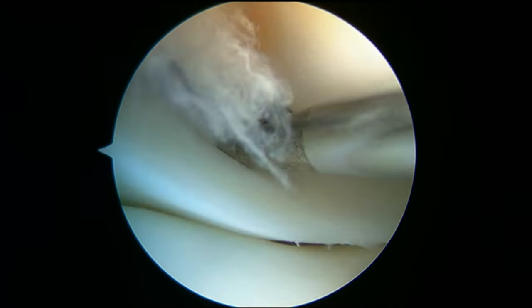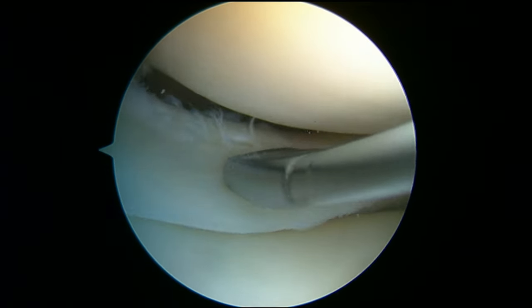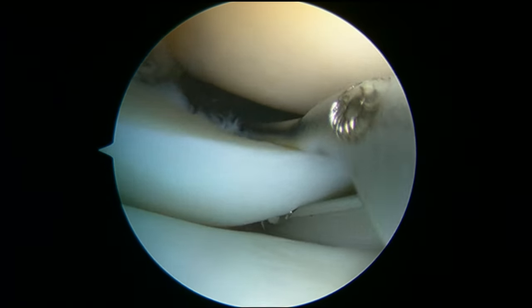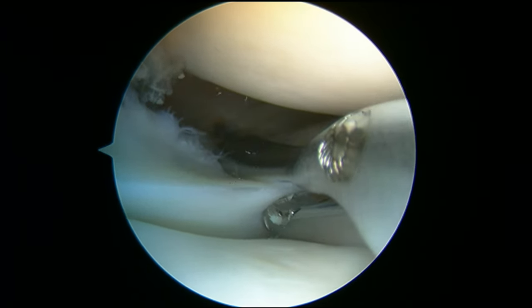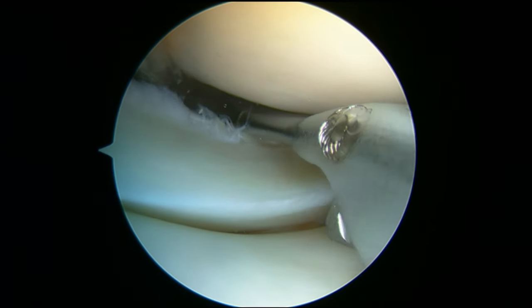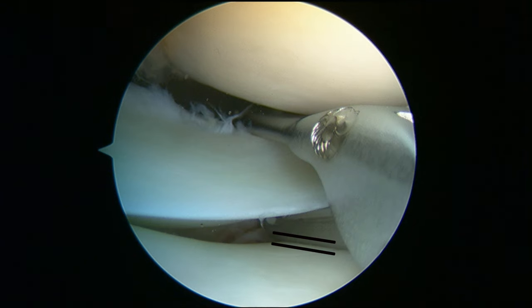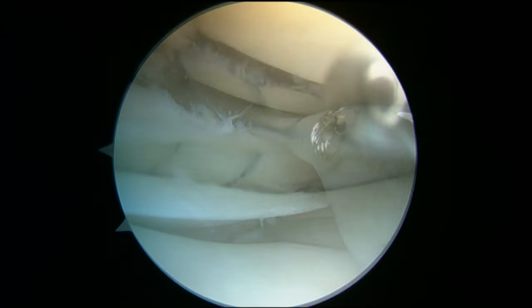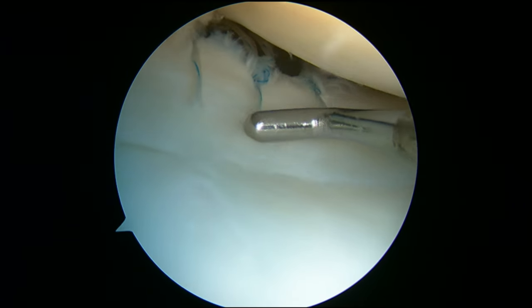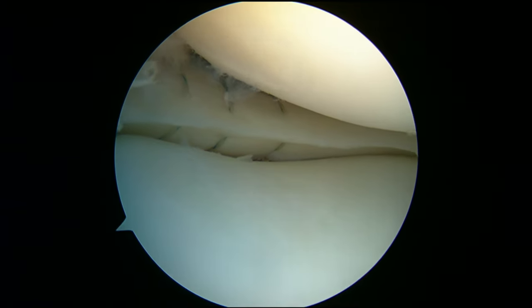Here's a quick clinical example using the same device. There's a vertical tear of the posterior horn of the lateral meniscus just central to the popliteal hiatus, and the upper jaw is placed behind the femur before the lower jaw is extended forward underneath the meniscus. Then the sutures pass from bottom to top on both sides of the tear, the lower jaw is retracted and the device removed. Here's a slow motion replay of the approach vector — notice that as the lower jaw is extended under the meniscus, it's optimally parallel to the tibial plateau in the region under the tear. I like the circumferential compression stitch because it allows reduction and compression of the top and bottom of a vertical tear at the same time, and because it doesn't entrap the meniscus to capsule and minimizes neurovascular risk.